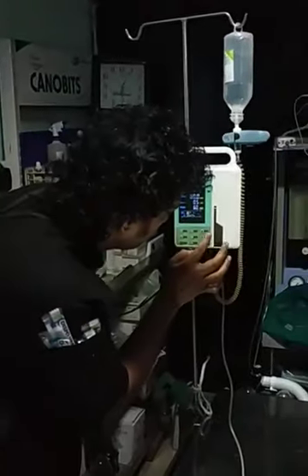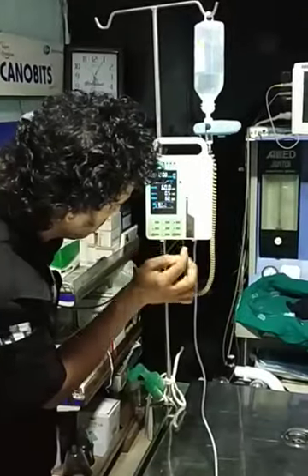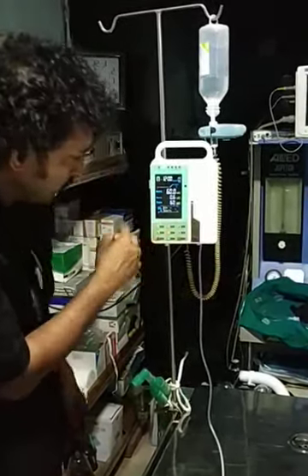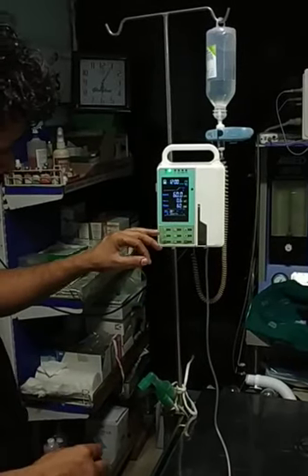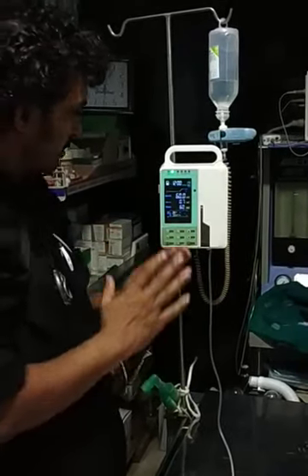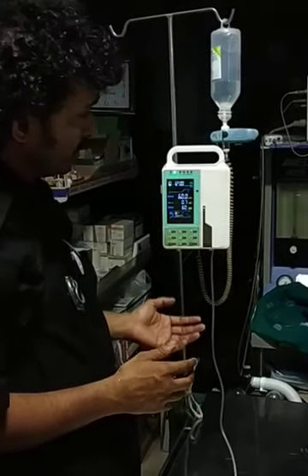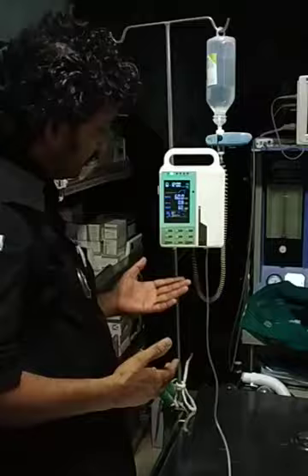So this is one beautiful piece of equipment. We have just explored it. We have an increase/decrease option, a start and stop option, a set option, a select option, a mute option, and if you want to change the setting there is a purge option. Really simple but yet very effective, and I would strongly recommend this as the equipment of choice if you want to go for an infusion set.